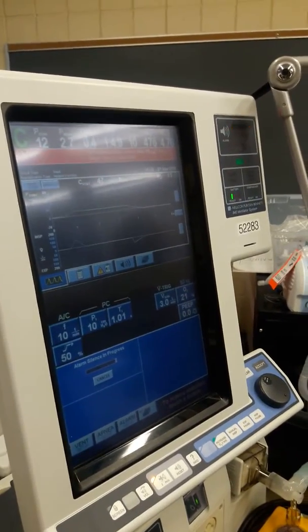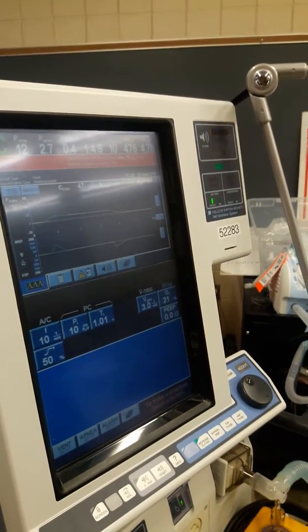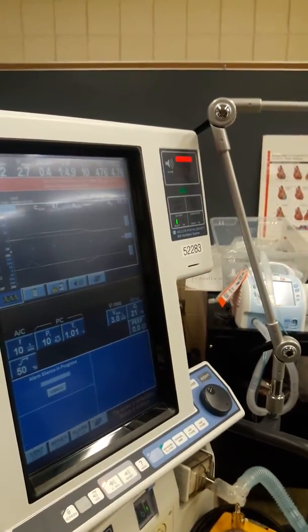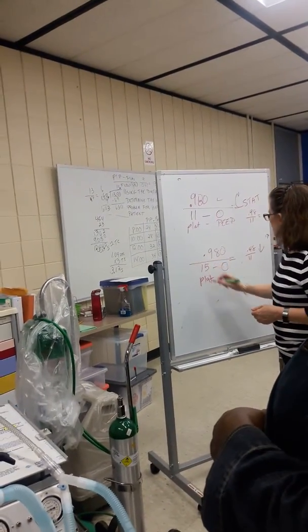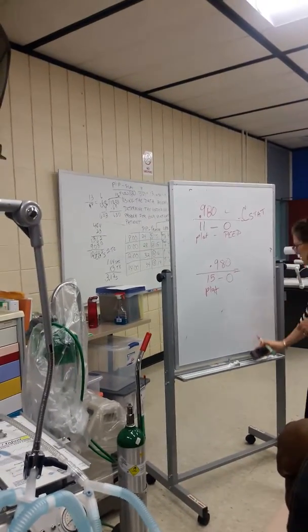The compliance is changing because your volume is going down, but let's hypothetically say I keep this at 0.980, but my plateau went up to 15.